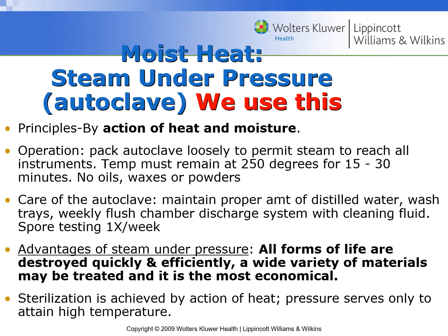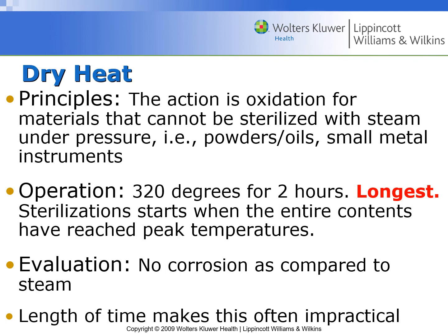Sterilization is achieved by the action of the heat. The heat is what is going to sterilize them. The pressure serves only to attain that high temperature. So the pressure comes, it gets up and up and up until it gets to a certain temperature, and then it has to be in there for 15 to 30 minutes, ours is 30, and maintain that temperature, and that's what the pressure's for.